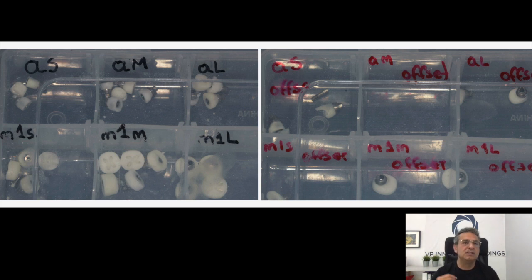So as soon as they see them go down to one unit or two units, they fabricate a couple when they have a bit of spare time. So the kits are never without parts. They're always topped up so that there's no last minute, oh, everybody's rushing when we're doing a surgery. Pre-plan, it's much easier.